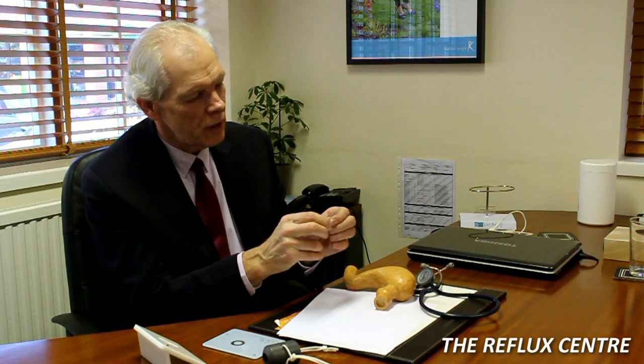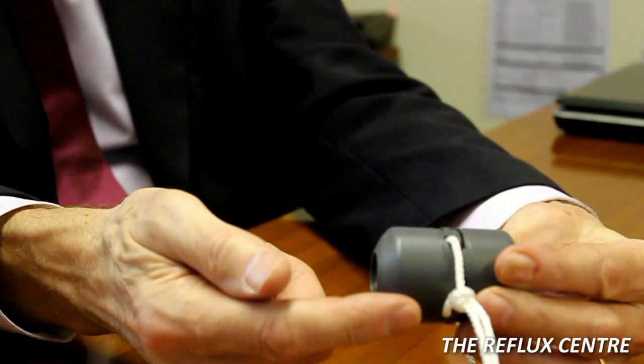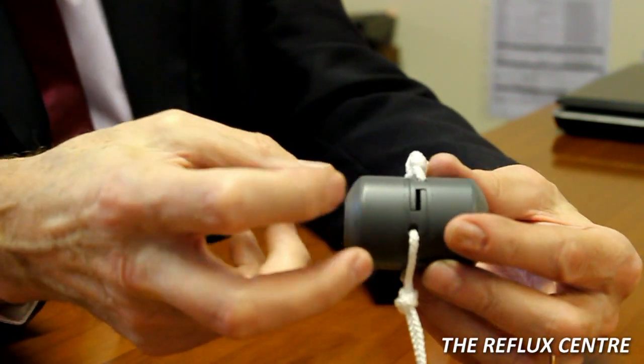We put it around the lower part of the gullet during the surgical procedure. You can see it open here and then we close it, and it's held closed simply by magnetic force. This is a much larger version of the locking mechanism I've just shown you. To show you how secure it is, we pull it and it comes apart, and you'll see how it comes together and locks in that position — and that's what holds this device in place.